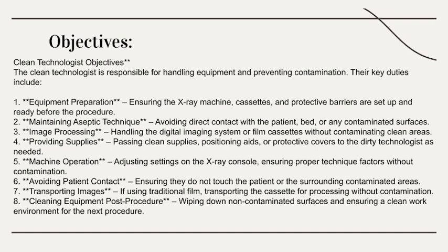Their key duties include equipment preparation, ensuring the X-ray machine, cassettes, and protective barriers are set up and ready before the procedure, maintaining aseptic technique, avoiding direct contact with the patient, bed, or any contaminated surfaces, image processing, handling the digital imaging system or film cassettes without contaminating clean areas, providing supplies, passing clean supplies, positioning aids, or protective covers to the dirty technologist as needed.